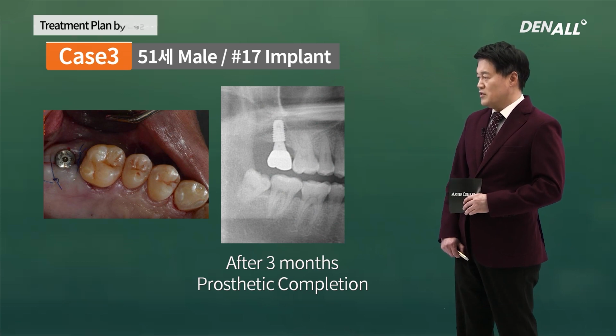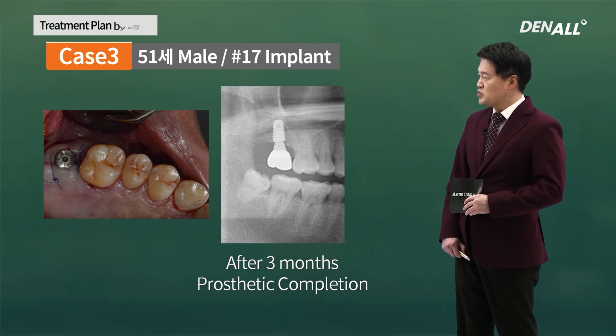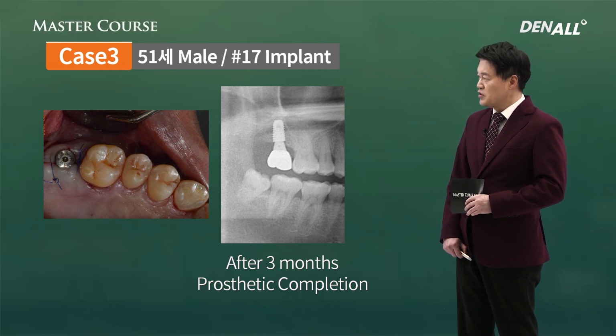After 3 months, prosthesis was delivered, implant was placed in the direction that we wanted, and socket lift was used. Osteotome was used for socket lift, and it is relatively stable.